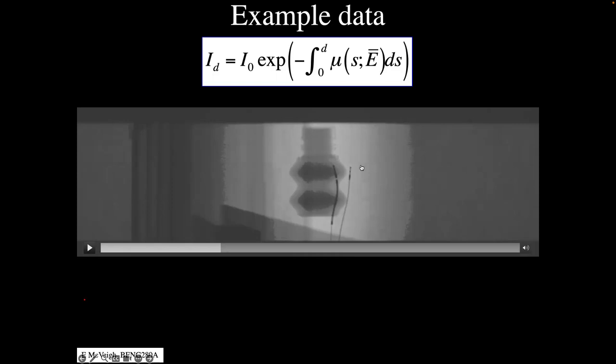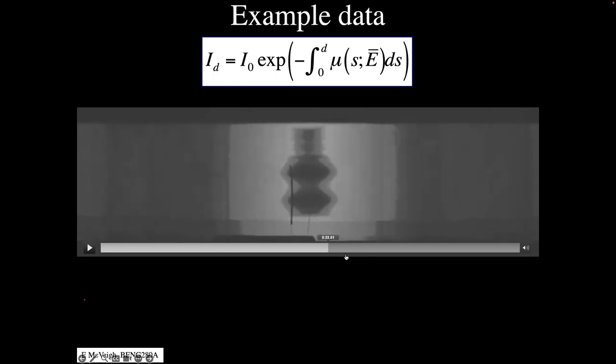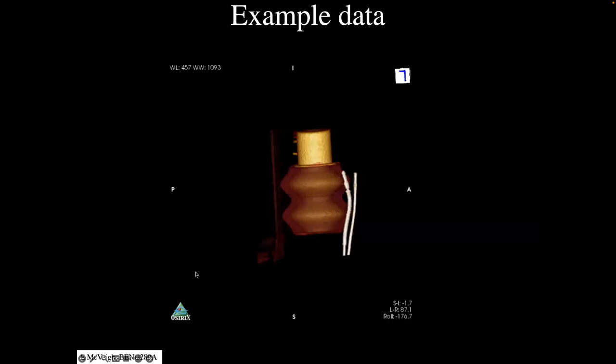If you zoom into this, you can actually see a rectilinear grid. Remember, we saw those kind of chip things they put in there. You can actually see the pattern of those chips there. And so here we're just rotating around a few times to get enough projections to make an image. And so this is what's reconstructed from that.